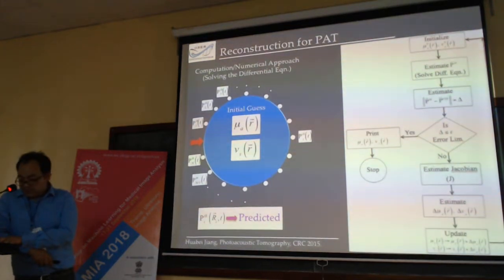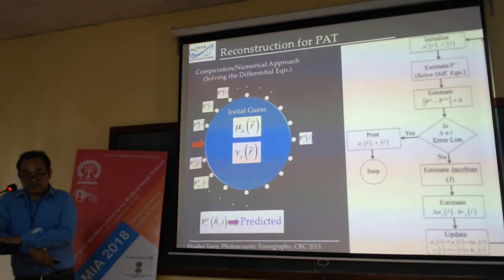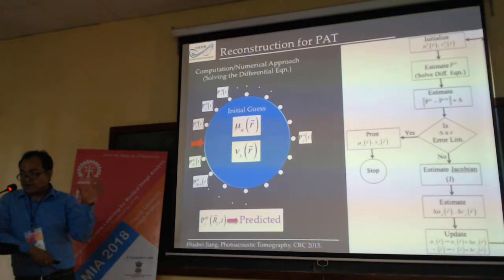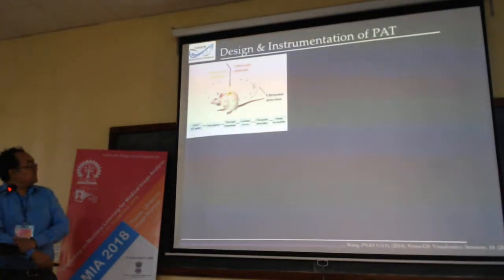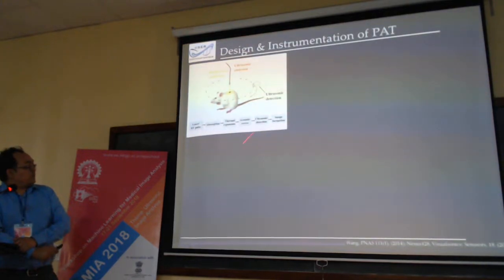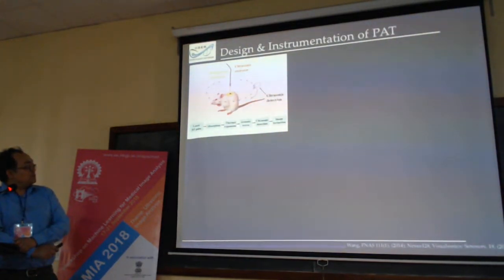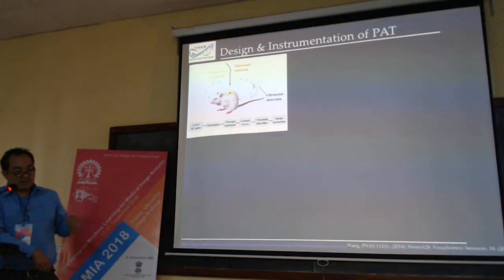This is about the implementations of the reconstruction technique for photoacoustic tomography. I think in the previous class, someone would have covered these things very rigorously. So about the design and developments, as I have told you, at the beginning people used to keep one sensor and move it around.